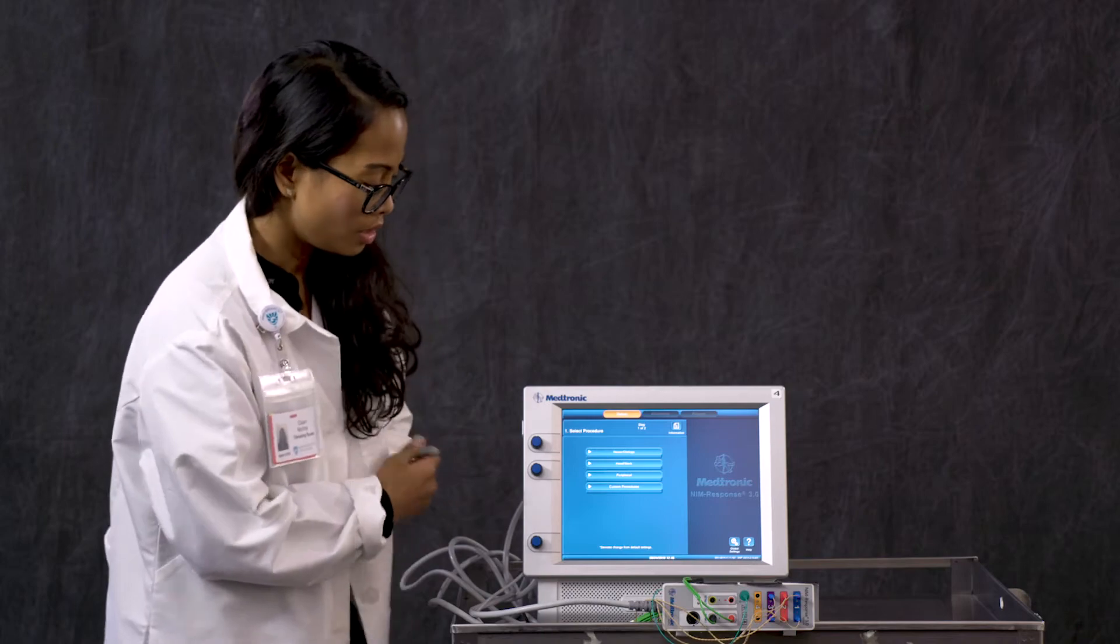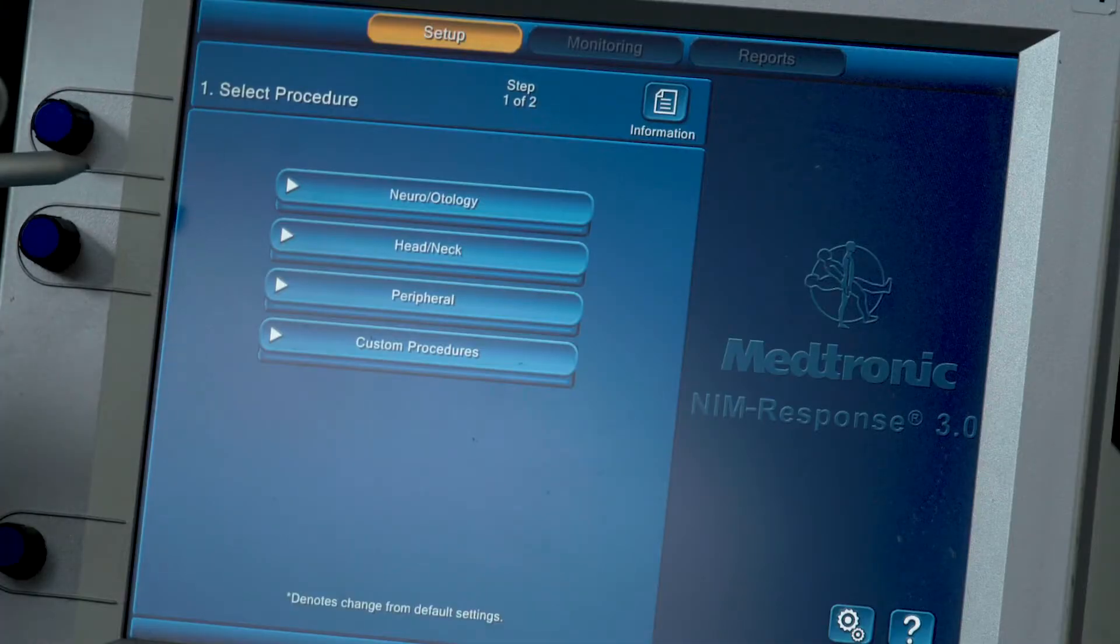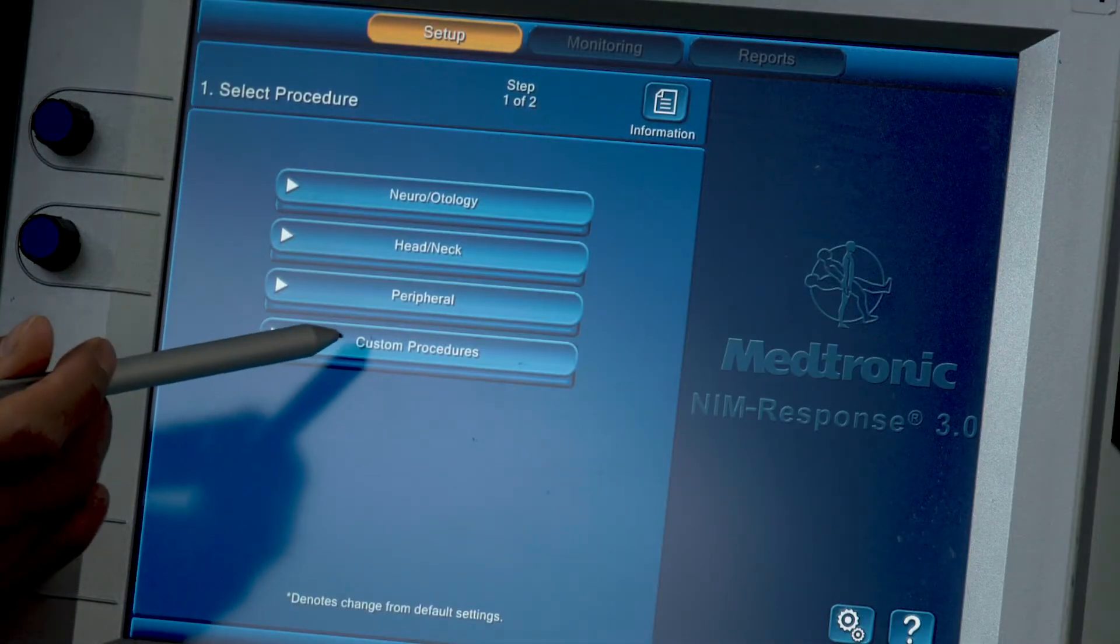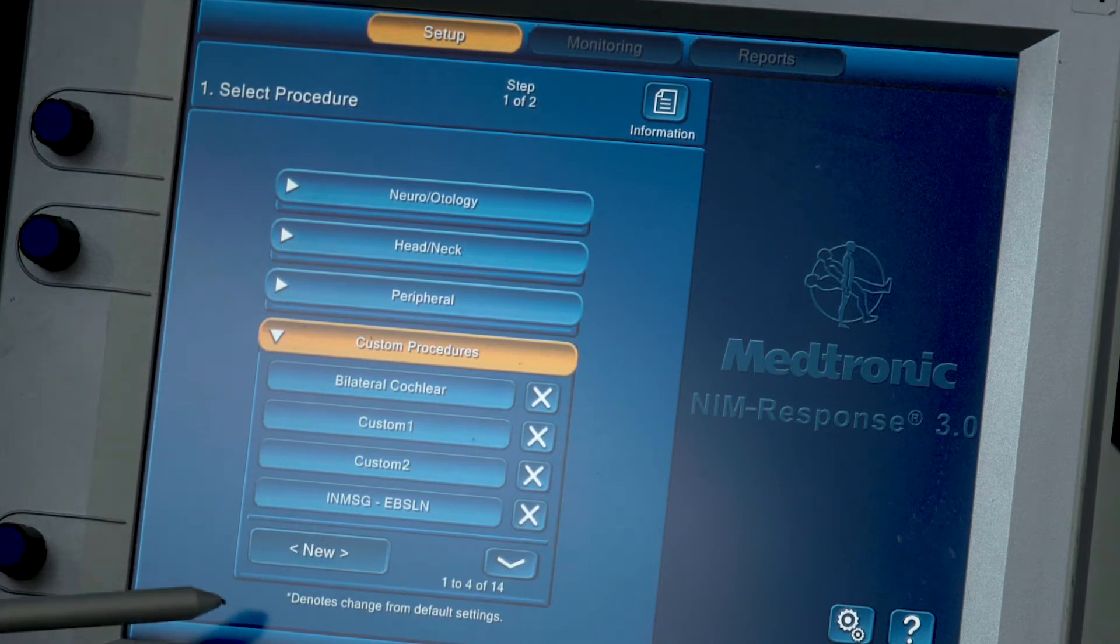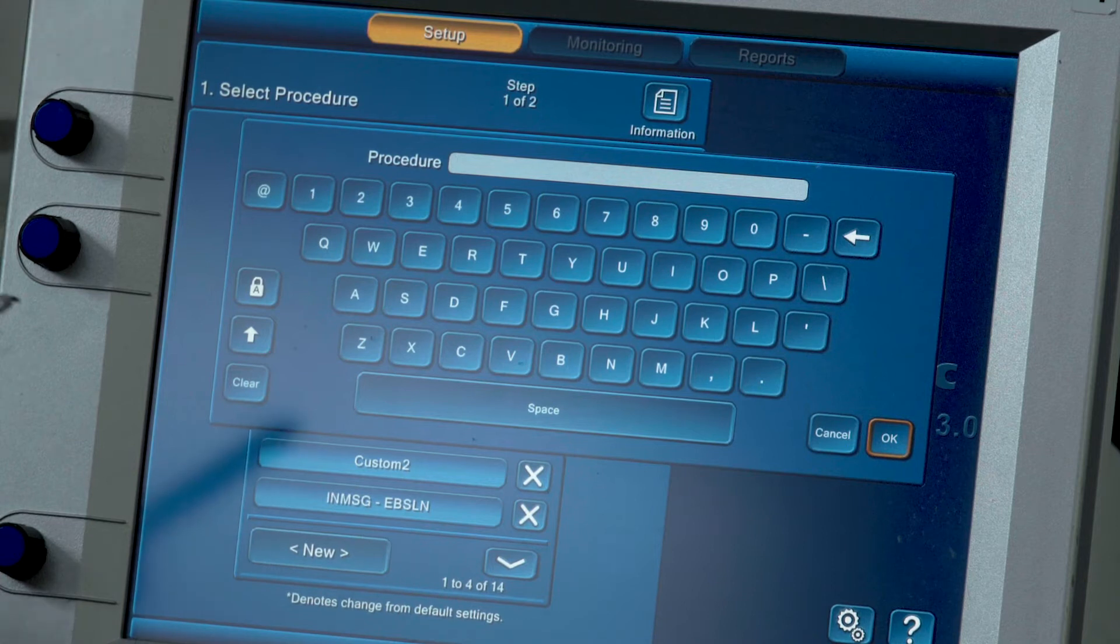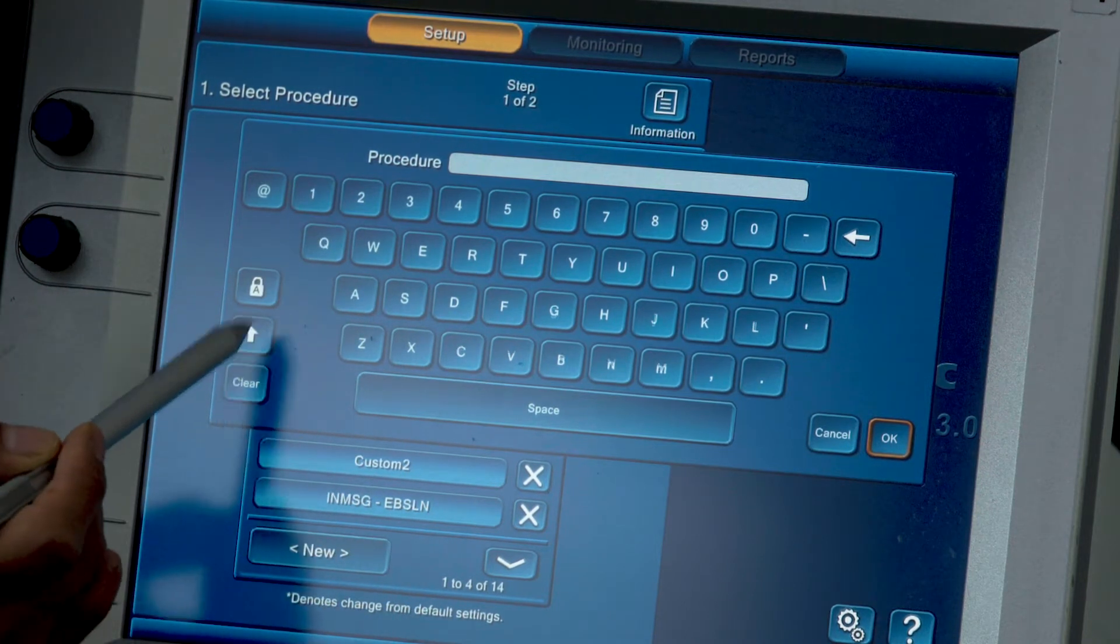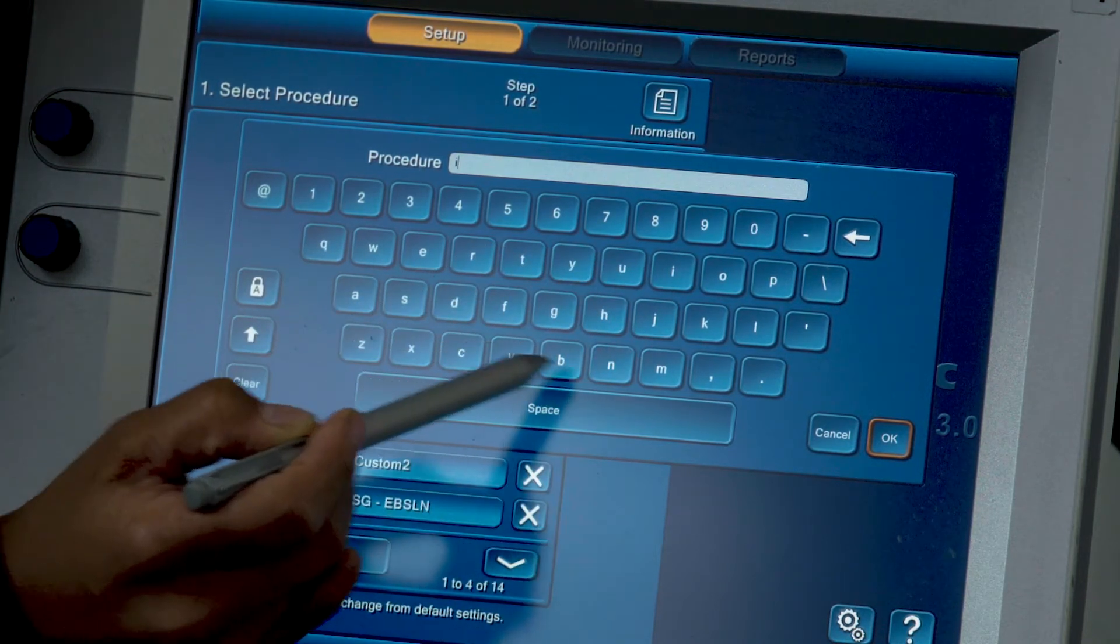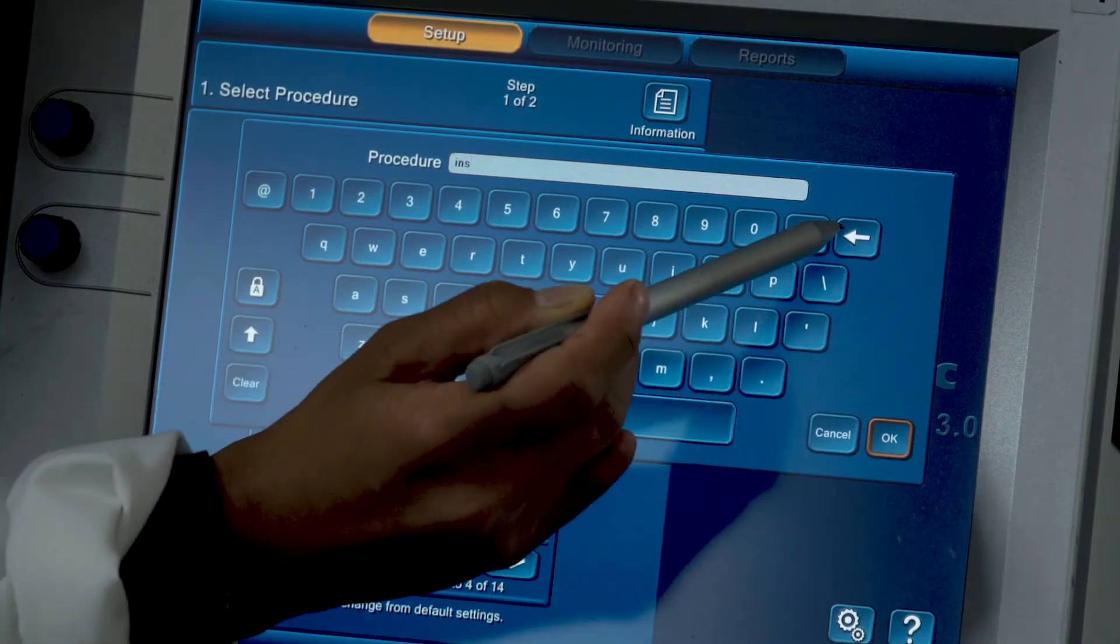So we have turned on our NIM and this is our main screen, the setup screen. Once you get to the setup screen, you are going to select a procedure. Here we are going to make a custom procedure. You're going to pick new, and let's say in this case we are going to call this Inspire Therapy. Press OK.